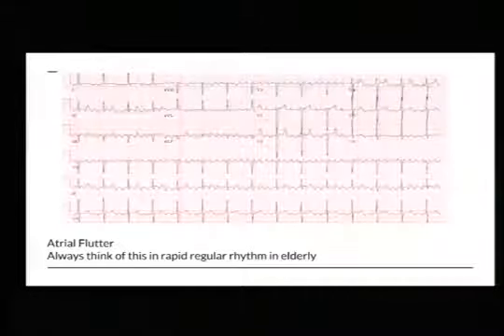It often will. Other times it might slow it down enough for a while to see the flutter, but typically as that wears off, it'll kick back up. So that's why we always hook them up to the rhythm strips while you're doing the adenosine, because often you'll pull out whatever underlying rhythm they have that then you'll change to treat, because you've slowed that ventricular response down enough that you can see their underlying atrial rhythm. So it's never wrong to try the adenosine. Often we'll do it, and then you see, oh, there's flutter waves. Now I go to the cardizem.